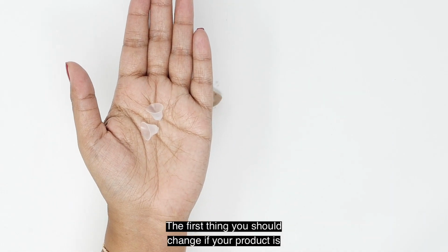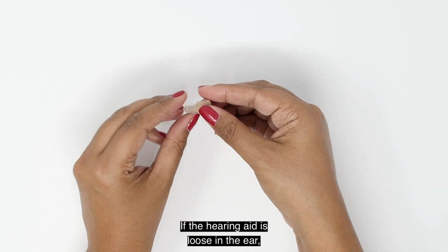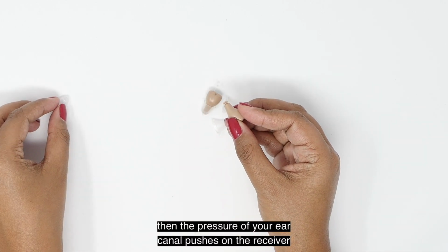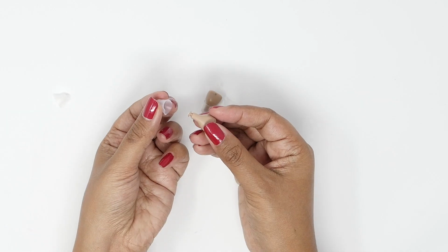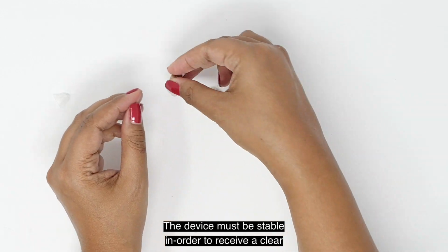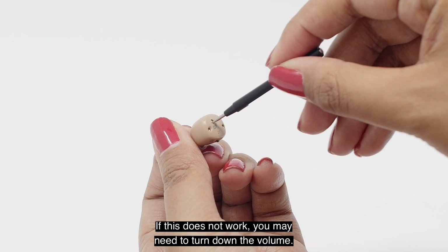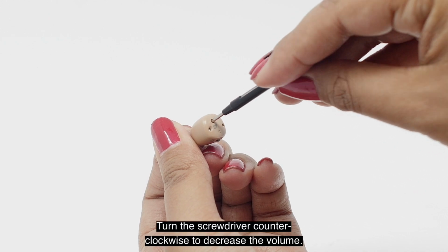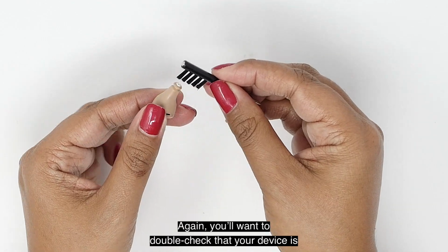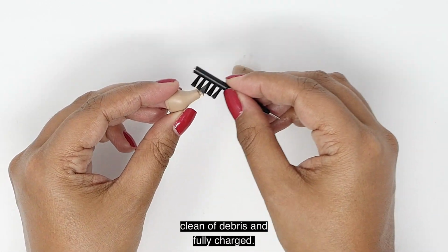The first thing you should change if your product is whistling is the size of your earbud. If the hearing aid is loose in the ear, then the pressure of your ear canal pushes on the receiver and not the earbud. The device must be stable in order to receive a clear and crisp sound. If this does not work, you may need to turn down the volume. Turn the screwdriver counterclockwise to decrease the volume. Again, you'll want to double-check that your device is clean of debris and fully charged.